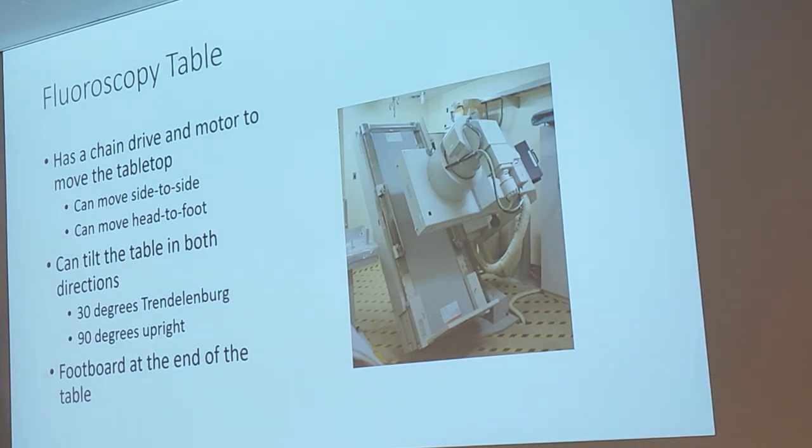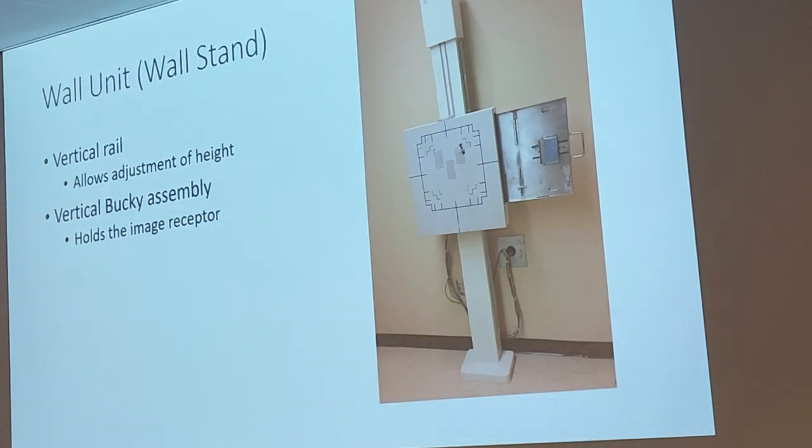So there's stuff going on inside the patient that's in motion, right? Like, let's see the patient swallowing, they're drinking something. You take a video so you can see the stuff going down the throat. X-ray movie. X-ray of movement.